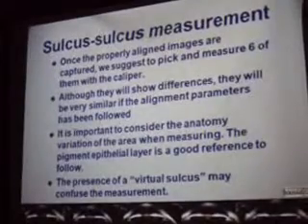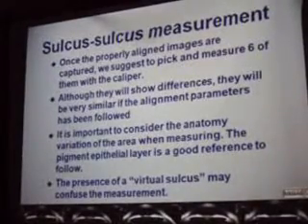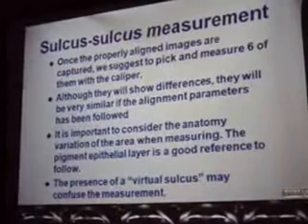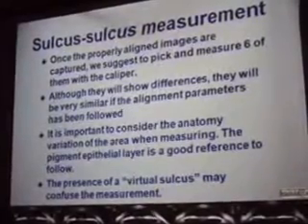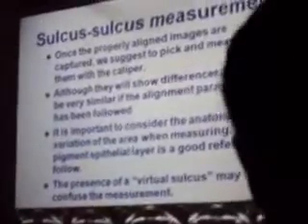Once the properly aligned images are captured, we take six, discard the largest, discard the smallest, and average the remaining four. This will provide a very accurate clinical measurement of the sulcus. I'm not telling you that we are just getting the truth, because it's a very irregular area.